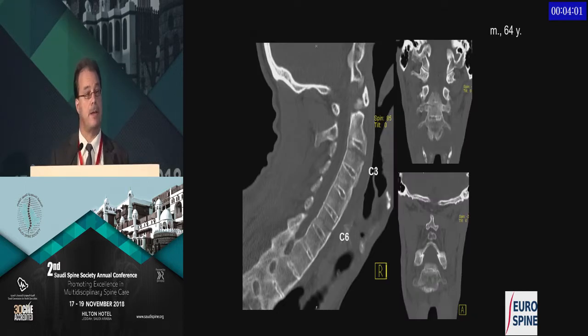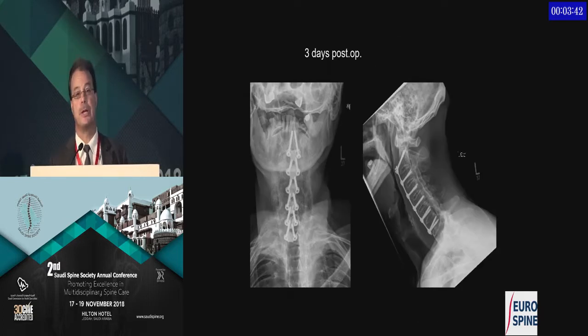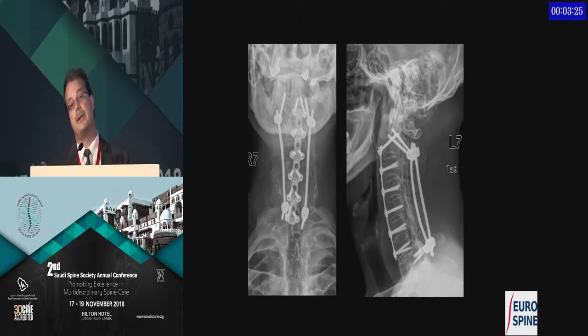Another situation is a patient with ankylosing spondylitis. This is a double fracture, and I would advise you to always go for a total spine in these patients, because in a high percentage you find multiple fractures. Like here, a double-site fracture in the cervical spine, 5 segments bridging from anterior. Motion preservation, of course, is never an issue with these patients because they're ankylosing. So you can go forward and fuse your 5 segments with an anterior fixation, and then again it usually needs a posterior tension band.